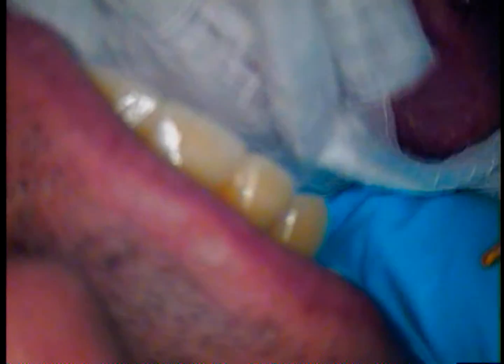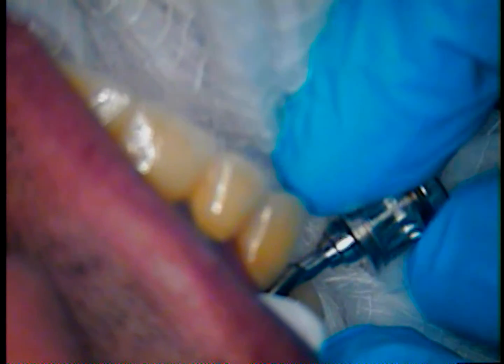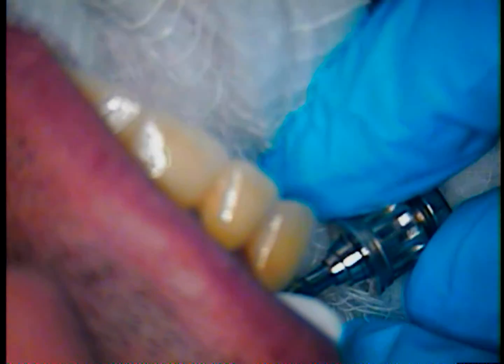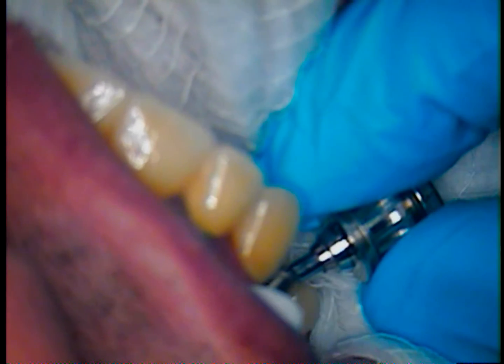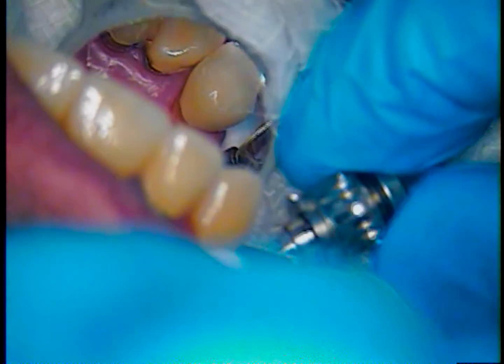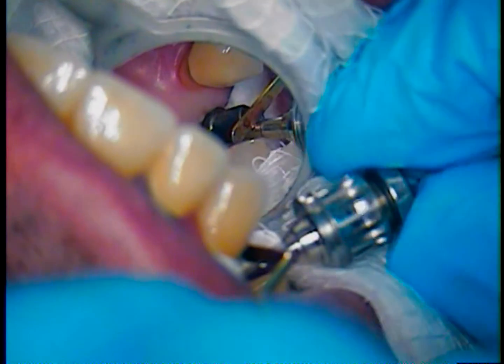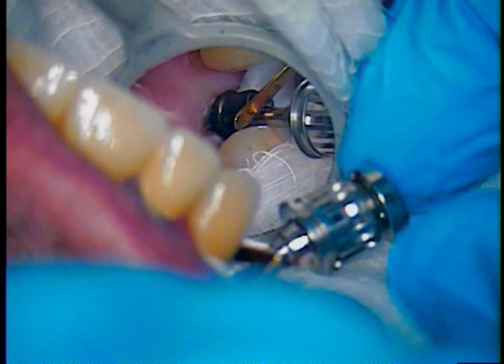We're going to turn it around — what looked like the mesial is actually the distal. So I'm going to turn it completely 180 degrees and insert it. Alignment is important. Angle abutments are used whenever an implant fixture is placed at an angle in bone. We're going to find out just how much the angle is here since this is a custom-made abutment. Now I'm inserting and you can see how the tapered end goes in toward the patient's mouth. I'll go back in with an instrument to hold it in place while turning the driver, and slowly do that. The tissue is still retracted with the gauze.